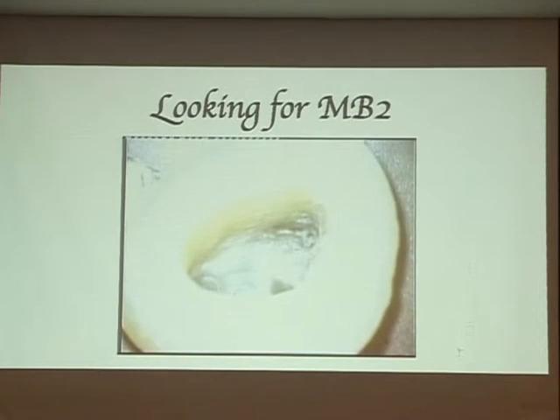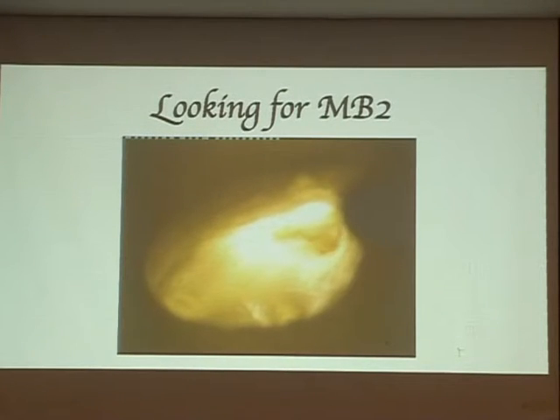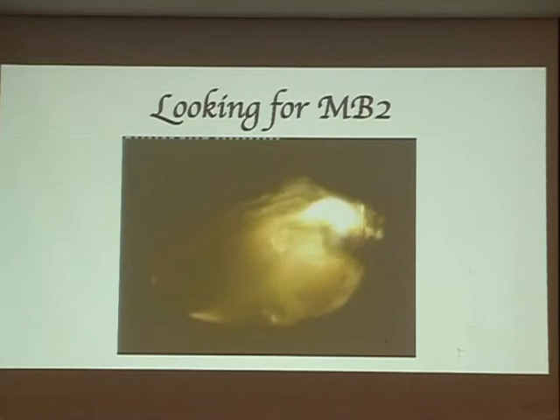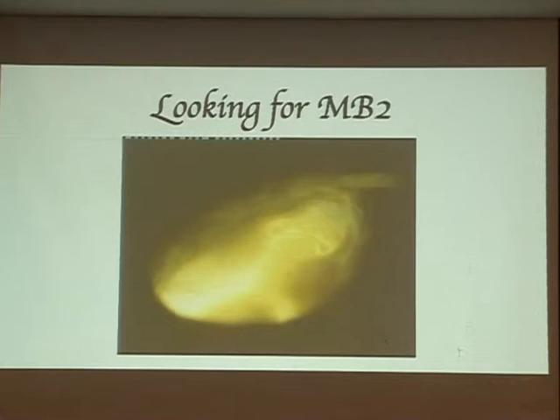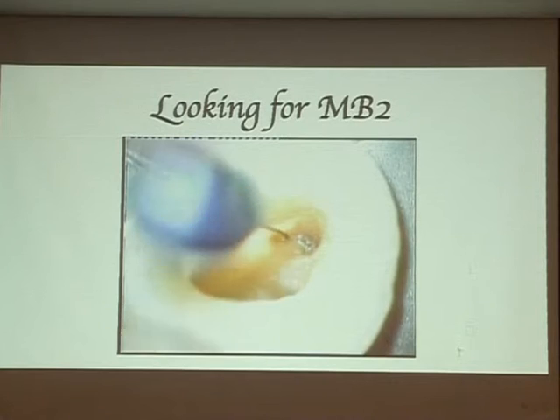We suspect there's a canal there. Once you remove the superior secondary dentin, you can see the possible entry of the MB2. So you can put a file in. It's a very conservative cutting, because if you're using a bur, first, you can't see. Your handpiece head will block all your vision. But with the endosonics, you have a very good visual approach to your working site. So you can put your file into the MB2 and find the canal.